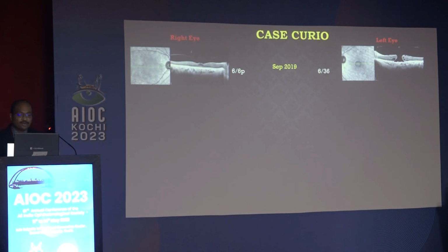Almost out of time. Okay, so this is a very interesting case which I quickly want to show you. In the left eye, the patient had a macular hole, went in for surgery.